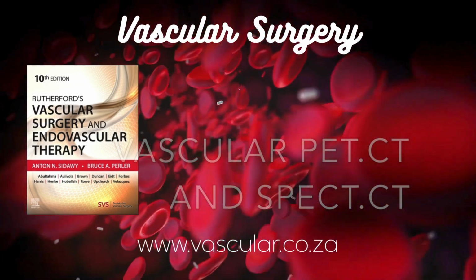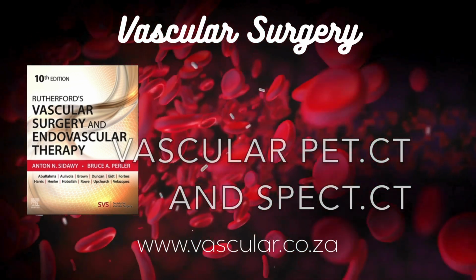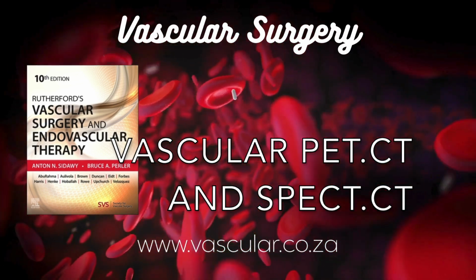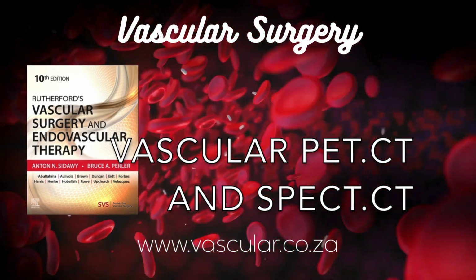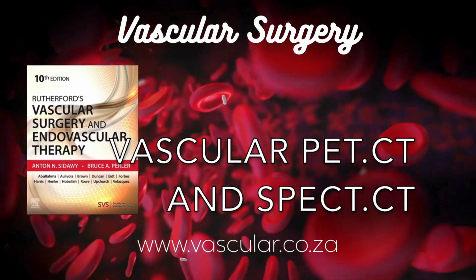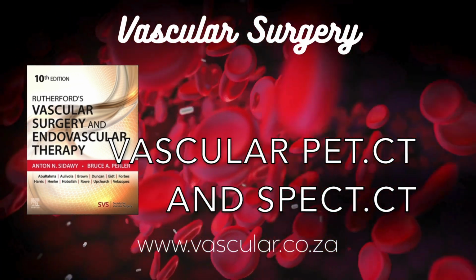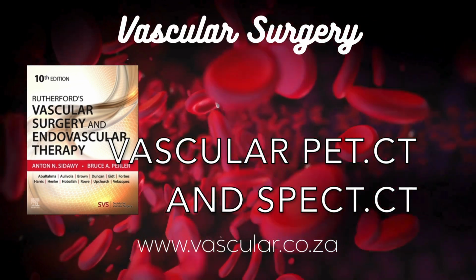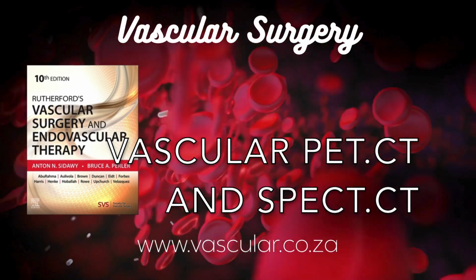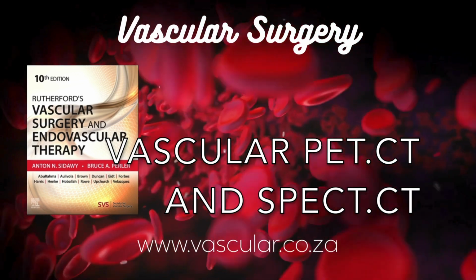Why preferred? FDG-PET generally gives better target-to-background ratios, meaning the infection stands out more clearly. The scan itself is quicker, usually done in 1 day versus potentially 2 days for WBC. You don't need to handle the patient's blood, which avoids potential biohazards and complexity, and you can quantify the uptake with SUV values. But WBC is still considered accurate. It is, especially with SPECT/CT. But it has limitations. False negatives can happen, maybe due to antibiotic use or chronic infection. False positives can occur from sterile inflammation, hematomas, or early post-op changes. Dual-time point imaging helps, but interpretation needs care.